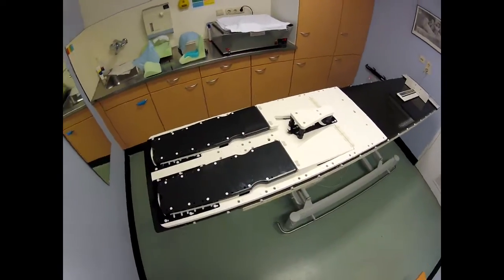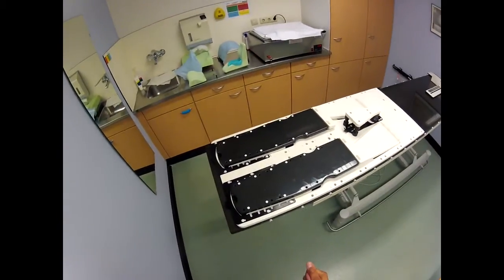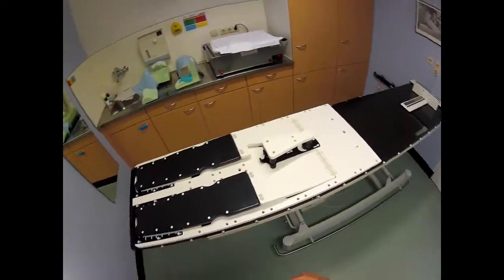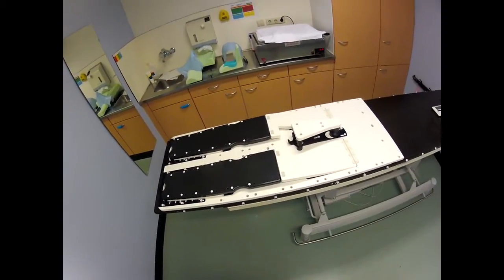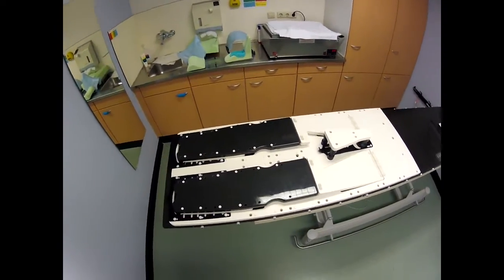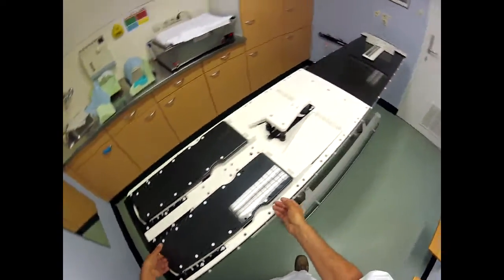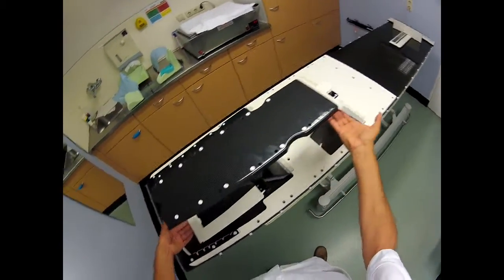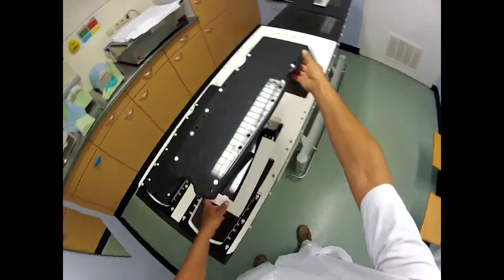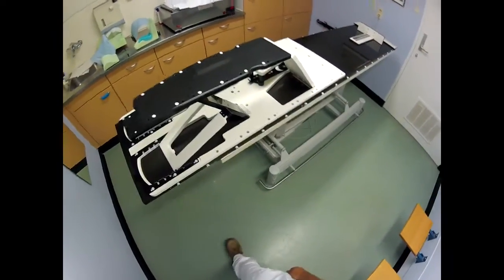It's from MicroMedics and I always wanted to try this. I especially wanted to see if it was possible to use all the techniques we use for positioning a leg on this thing, so that we wouldn't need the multi-fix anymore. You can move this in several positions — like so, like so — so that's nice.